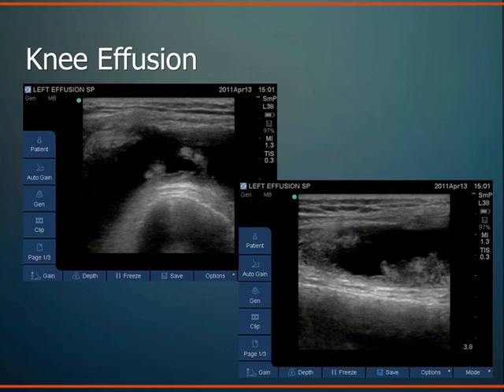This is an example, a patient I saw a couple weeks ago, joint effusion, just kind of classic presentation of knee arthritis, acute exacerbation, lots of pain, lots of swelling in the knee. This is that suprapatellar pouch of the joint space. So the knee joint space extends pretty far above the knee in that suprapatellar pouch. And when you have a joint effusion, that area can be extended or distended. And this is the fluid collection in there. So all fluid with some joint debris floating around. This is just a chronic kind of classic osteoarthritis presentation, seen quite well.